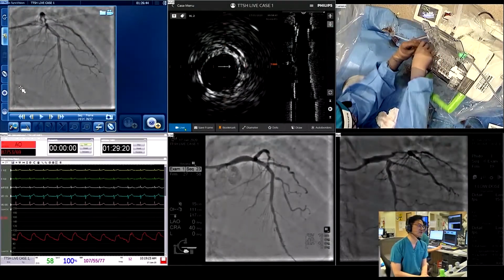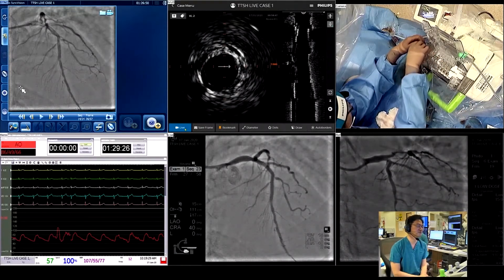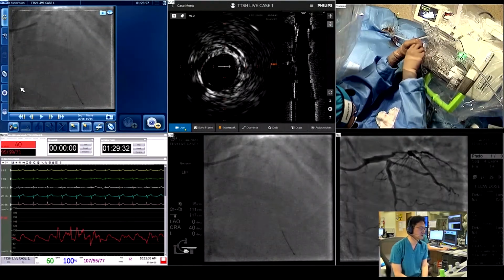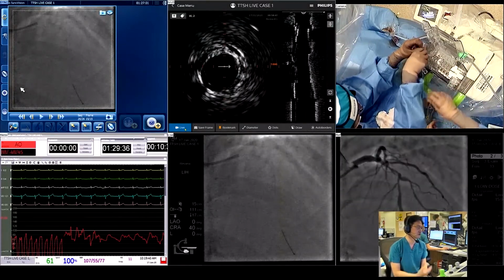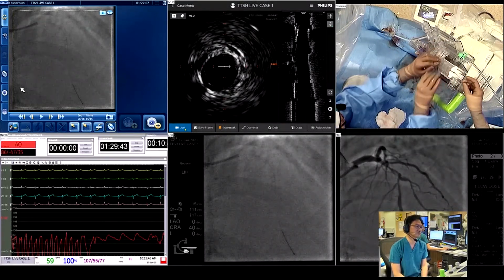We also noticed that gradually, in the simple case, you don't tend to use robotic, because if the simple case is 15-20 minutes, robotic setup already takes up all the time. So as you gain confidence, you'll be doing the more complex stuff, the ostial stenting, the long lesions. You gradually will end up going to the more type C lesions.